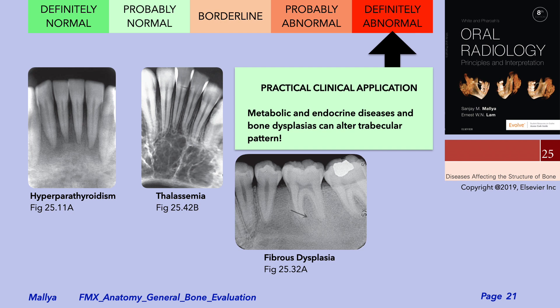Additionally, you do not see any lamina dura around the roots of the teeth. Next, consider the radiograph from a patient with thalassemia. In this condition, anemia drives a proliferation of the bone marrow. As the bone marrow cells proliferate, the bone marrow spaces enlarge. The radiograph from this patient is from the anterior mandible and demonstrates marrow spaces that are much larger than you would typically see in the anterior mandible.